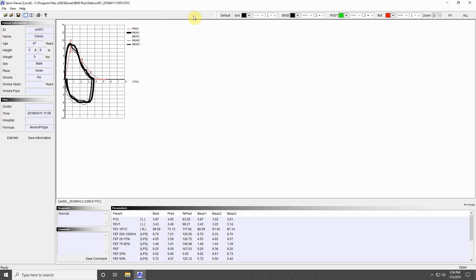The options to the left of this allow you to adjust the color, line style, and thickness of the measurement data. Press Default to return these changes to their original settings.